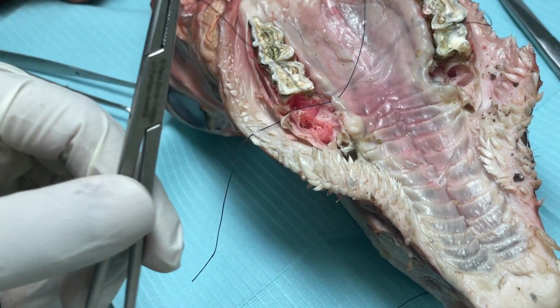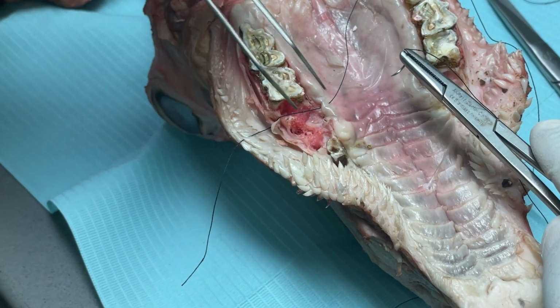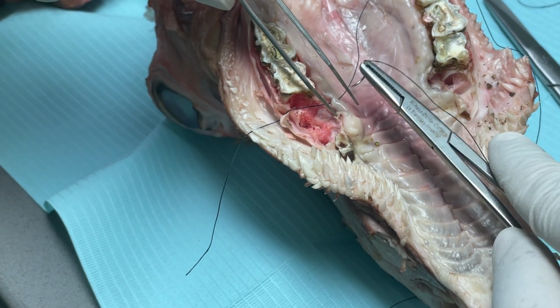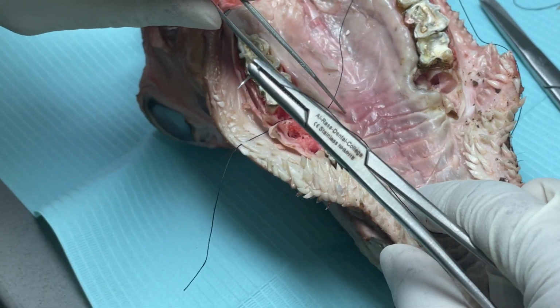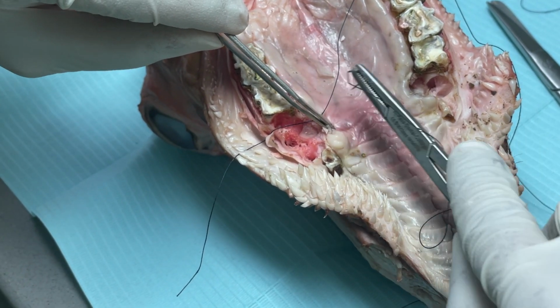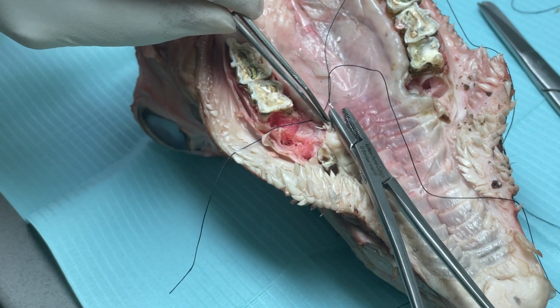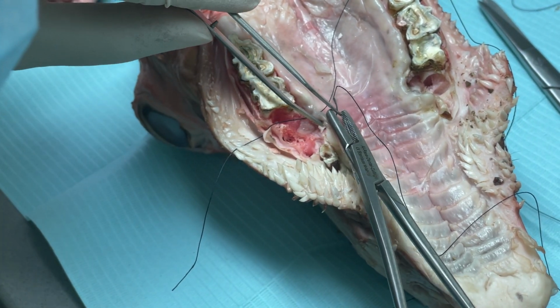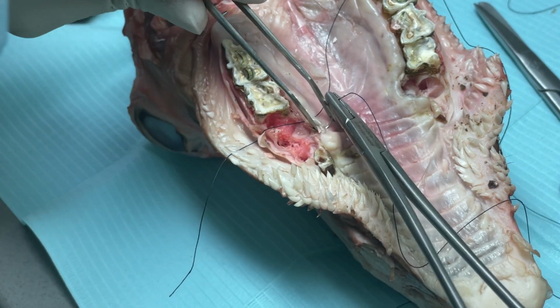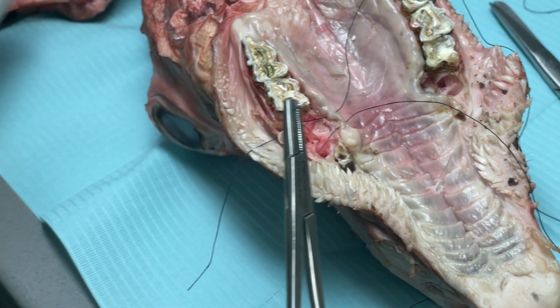From outside, from external here, that's where we'll leave a loop. That is if you are doing an interlocked. We are not doing interlocked, we are just doing a simple horizontal. Is it bite enough? Deep enough? Is the bite good? Okay, it is good. No problem.